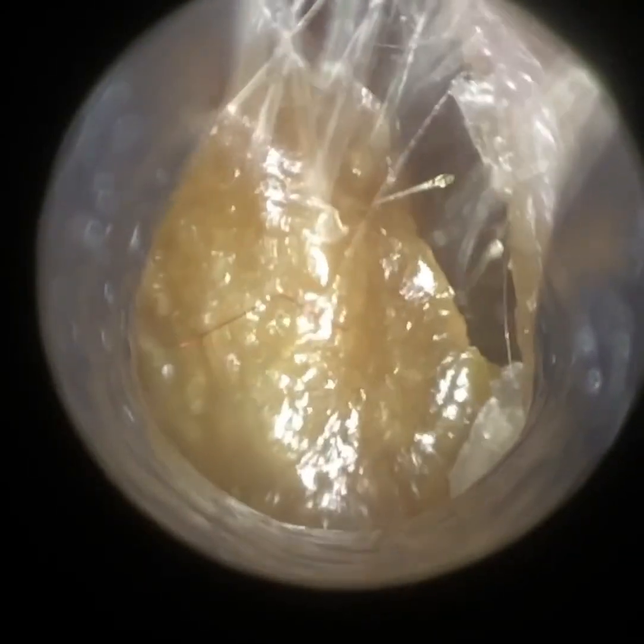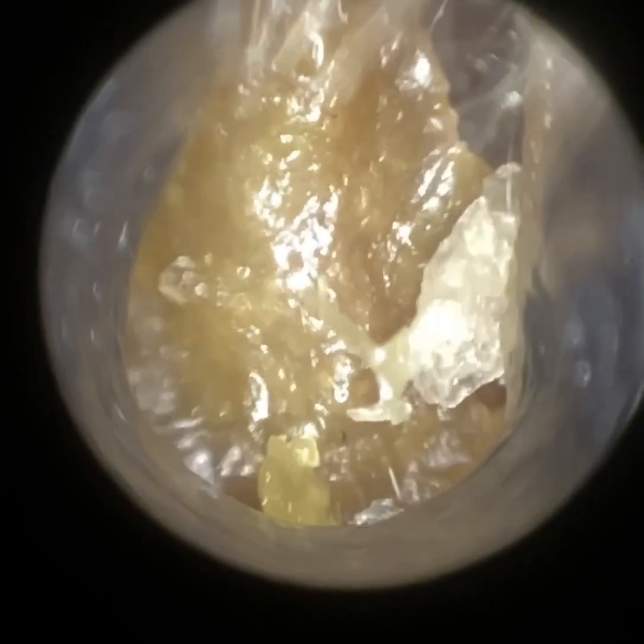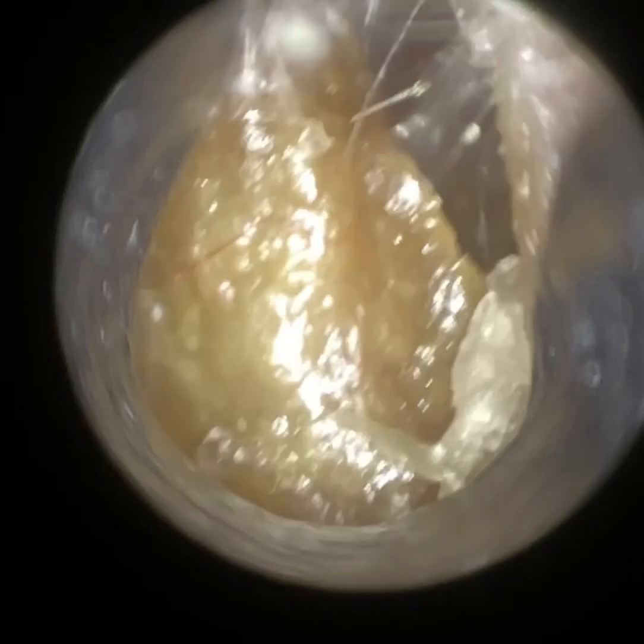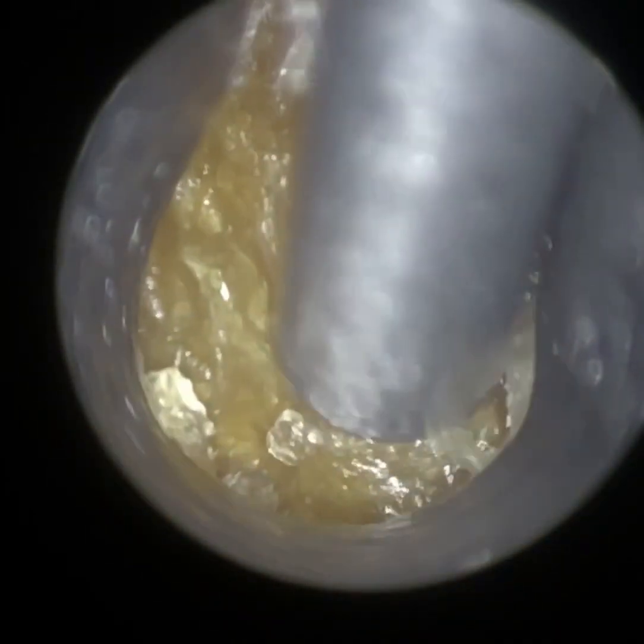Hi everyone, this is Mr. Neil, writer to consultant, audiologist and director of ClearWax. Thank you for joining me in another demonstration video of our recently developed Waxscope, which is due to be launched in early December 2022. If you are interested in the Waxscope, please do email info@clearwax.co.uk and we can add you to our mailing list.